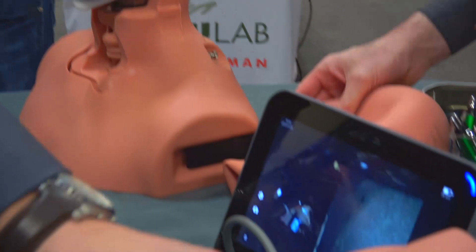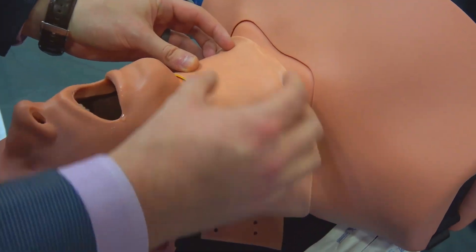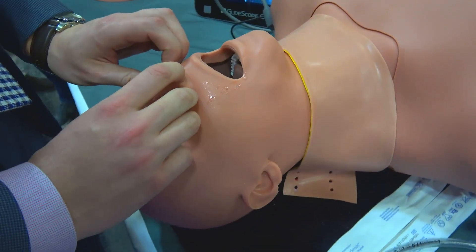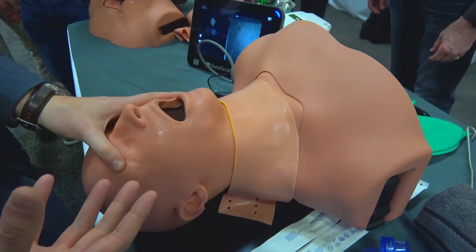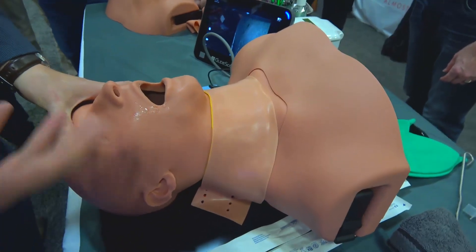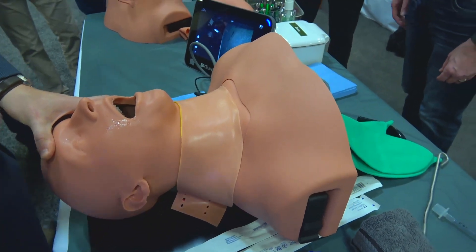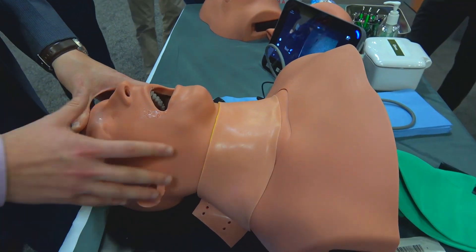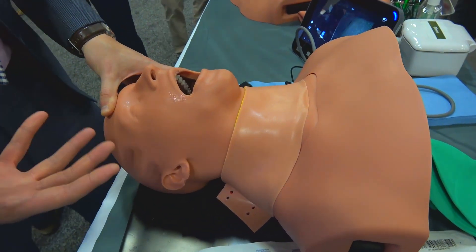It includes surgical crike — the original surgical crike from the trauma man system — as well as oral intubation and nasal intubation. The best part of Airway Man is that it's an easy, inexpensive upfront cost as well as an inexpensive ease of operation that will continue to make sure this system is in service for you at all times.